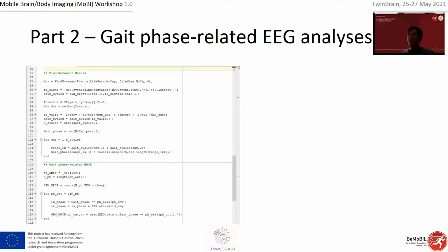Meaning I have all kinds of gait cycle lengths, but maybe there were some wrong detections or some problems in the recordings and/or the algorithm. And then I just keep everything that is somehow within a specific margin. And that's exactly this tolerance factor I was indicating in the very beginning. It's here. So all those that are exceeding or are below a specific threshold, I'm going to ignore. Meaning I again set a variable that indicates what is valid and what's not. I ignore everything that is not.